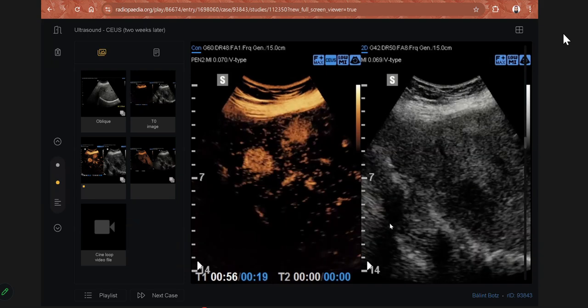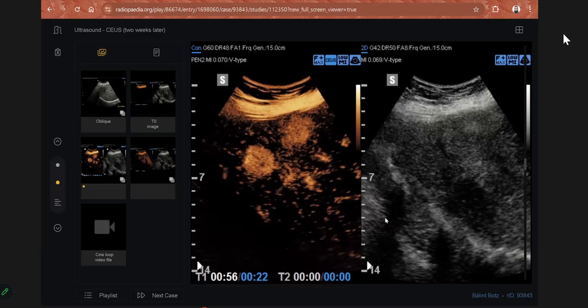Okay, so it shows enhancement. You think maybe arterial, then what is your differential? I will be thinking of the possibility of vascular mets, and the primaries I would be thinking of would be renal cell carcinoma or carcinoid tumors. Other differential? If they show a washout also, then I would think of multifocal HCC, hepatocellular carcinoma.